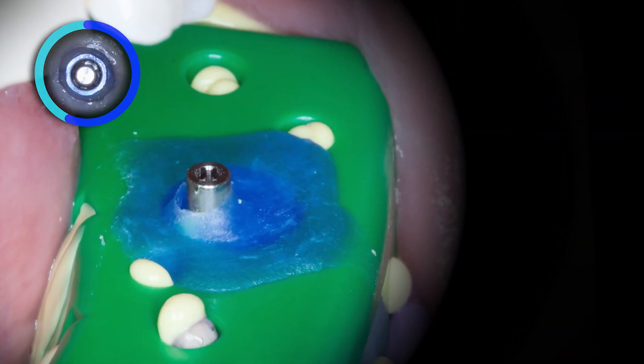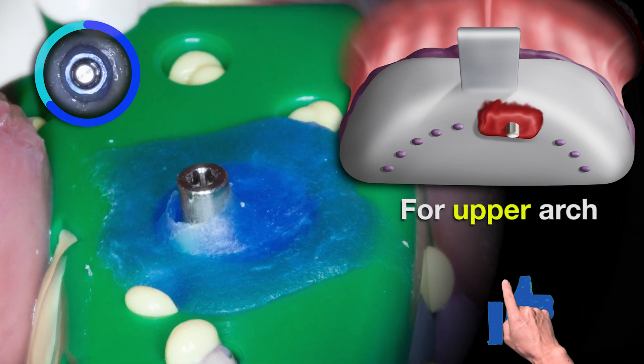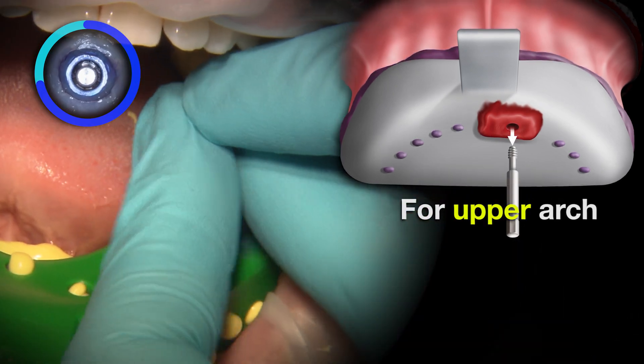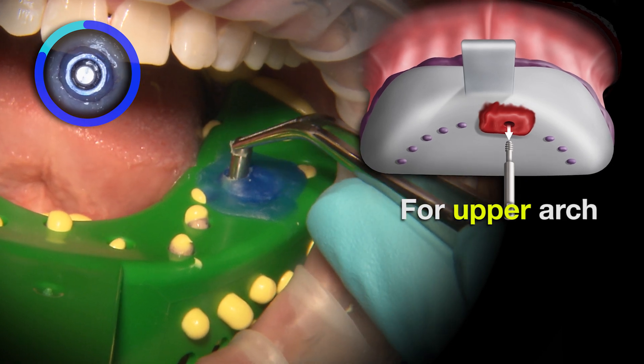As the impression material sets, I like to locate the top of the guide pin by pushing on the blue wax with either my fingertip or the handle of the mouth mirror. After the impression material is fully set, the guide pin is completely unscrewed before the tray is removed from the mouth.